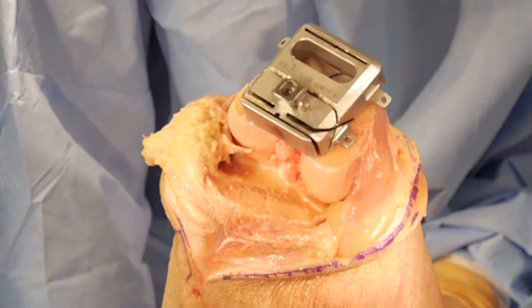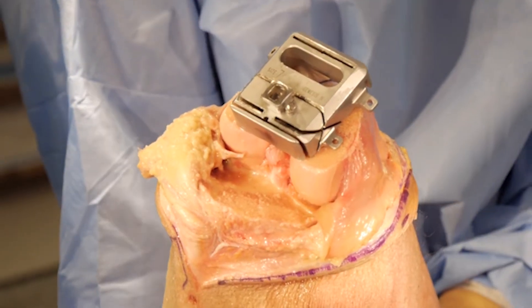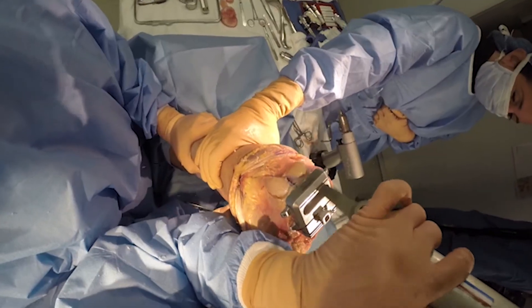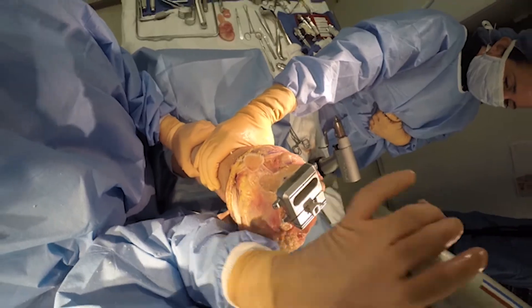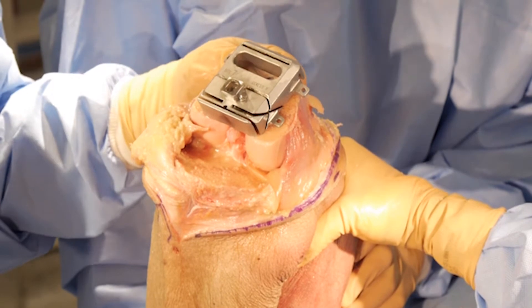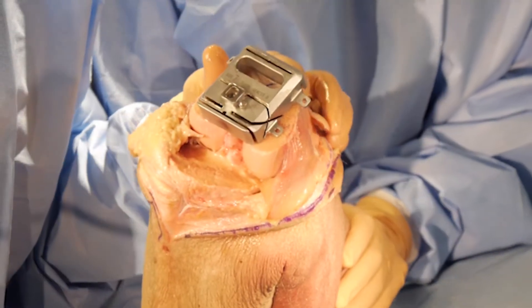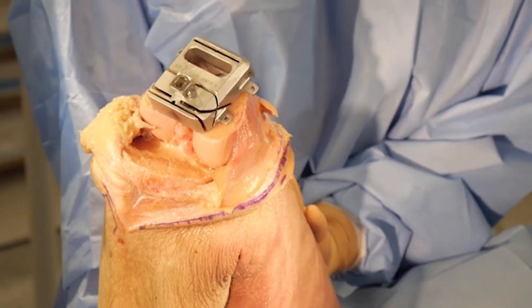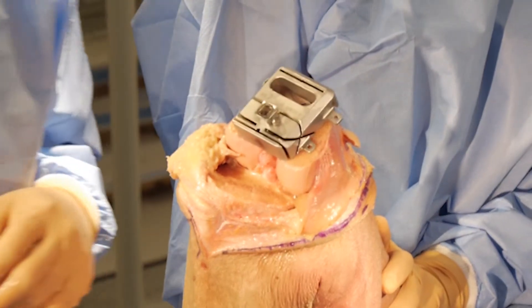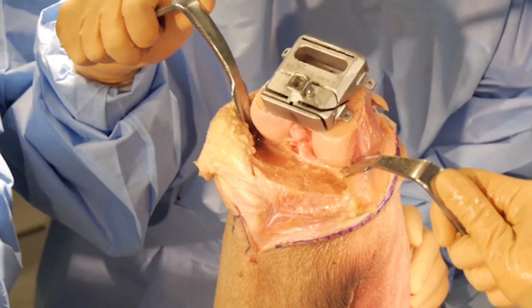The first cut I'll make is the anterior cut — I make this first so that if I need to downsize the femoral component I can. I'll start on the medial side, and that cut is perfect. I'm right on the anterior cortex, so there's no way to downsize the femur at this point. Once I'm satisfied with my size and rotation, the rotation is confirmed by the 'grand piano sign' — the anterior aspect of the distal femur should look like a grand piano, which it does. I'm ready to complete the remaining cuts on the distal femur.